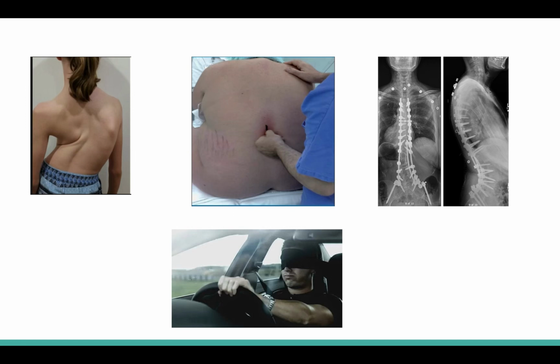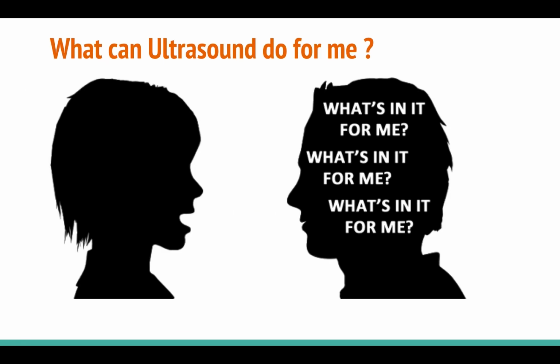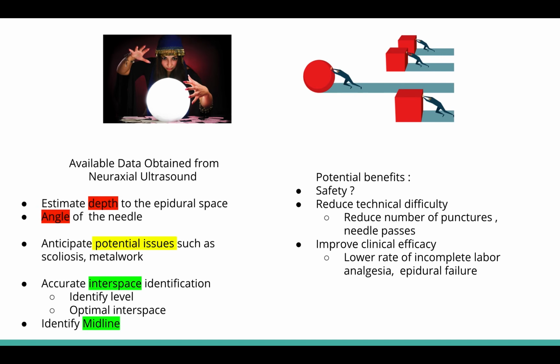So in some way, we don't really know where we are, and I think this is where the ultrasound is going to come very handy, and it's going to be a very valuable tool. So if you're curious by now, you may ask, what is ultrasound going to do for me? And the short answer is it helps you plan better. Before you stick a needle into the patient's back, you can get so much information that you would not know otherwise, or some information that you technically can get from the landmark technique, but it's a lot harder.